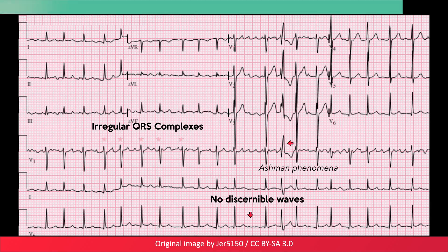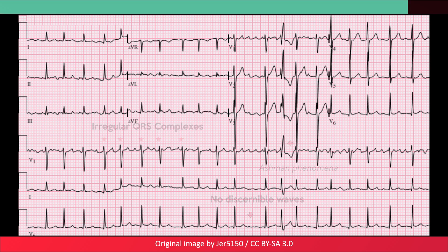Here is one final example of atrial fibrillation. I would just like to highlight something peculiar in the precordial leads. What we can see is a right bundle branch block pattern, but in a single beat. This curious finding is referred to as Ashman phenomenon.